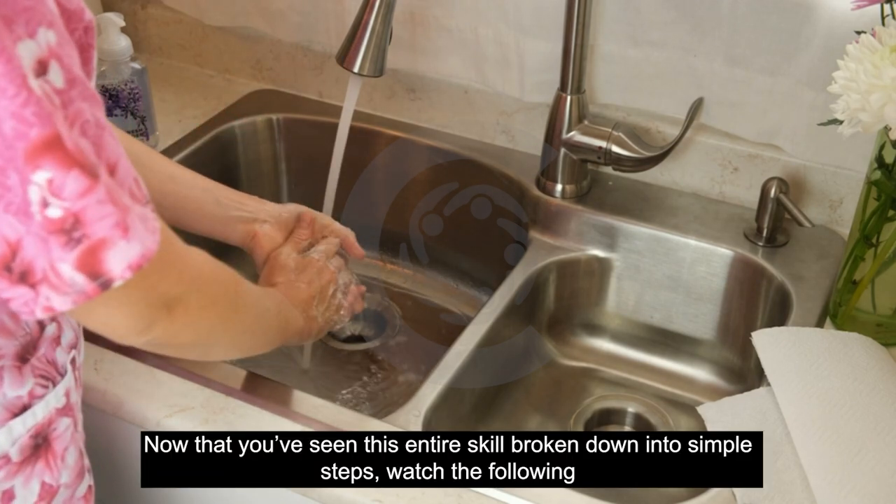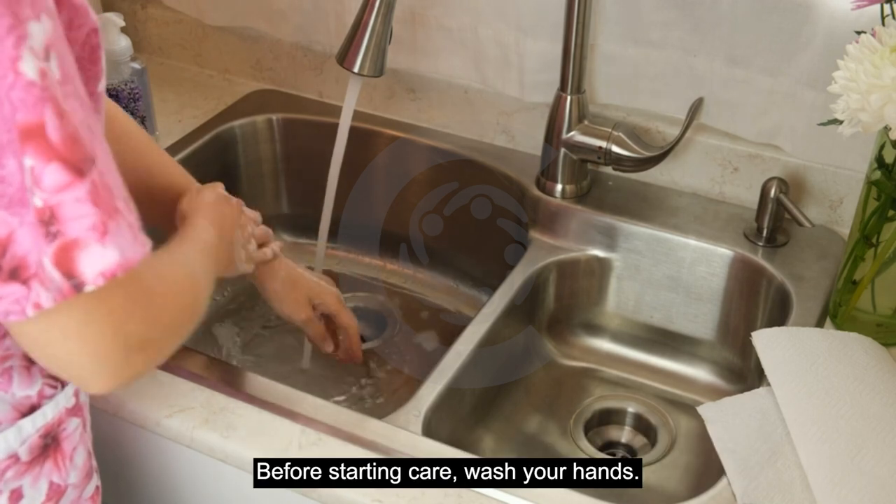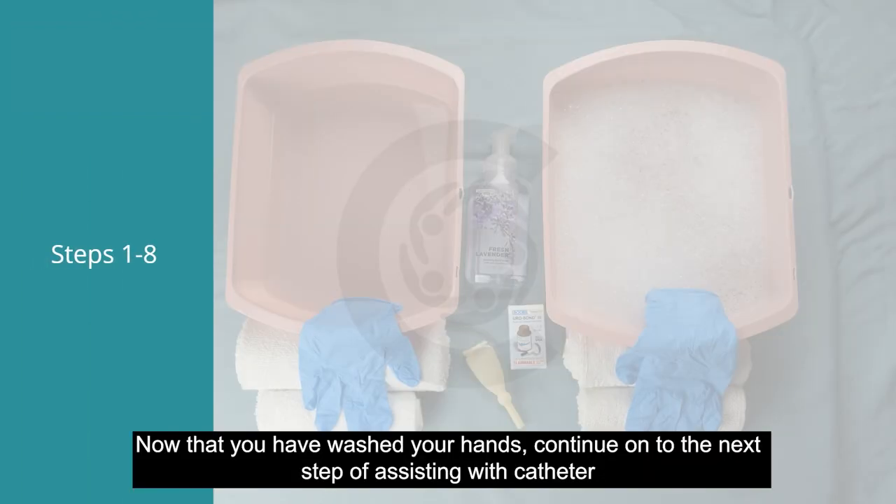Now that you've seen the entire skill broken down into simple steps, watch the following videos to see how the skill is performed from the first to the last step. Before starting care, wash your hands. Click next to continue.